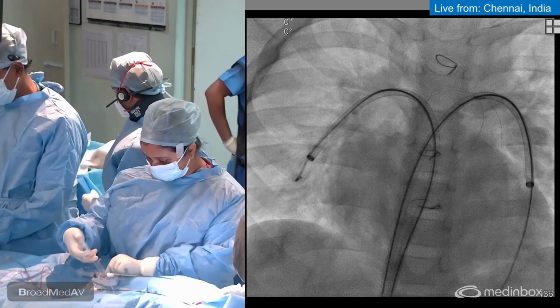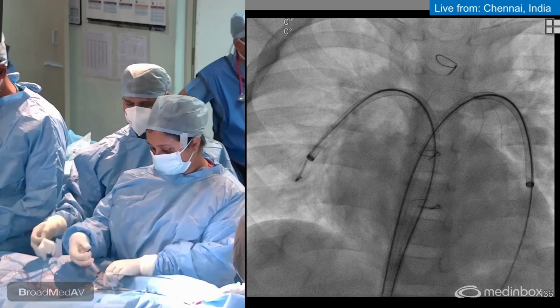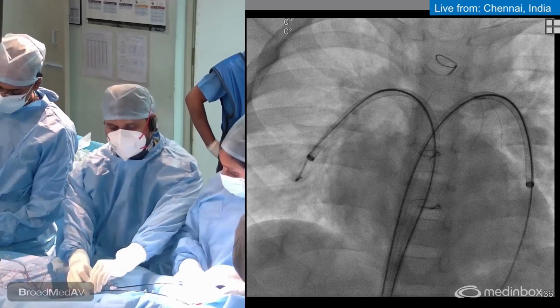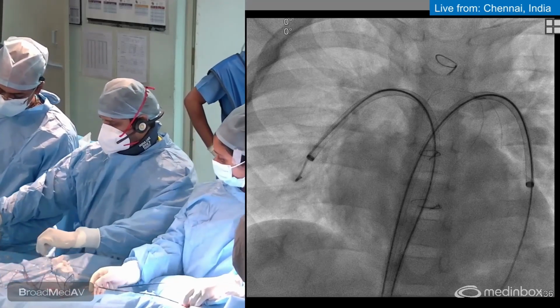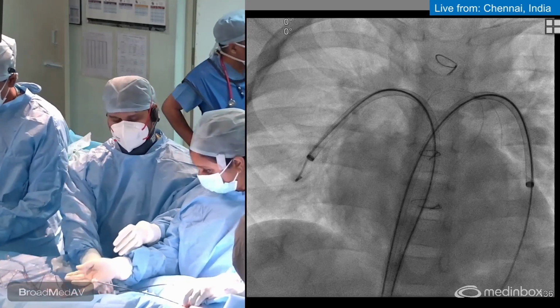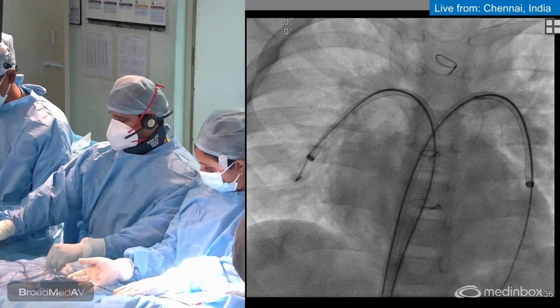This is a stainless steel stent. It has got a 035 lumen and it's a balloon pre-mounted stent. The advantage is that it is very low in its profile, and so the stent can go through a 7 French sheath.